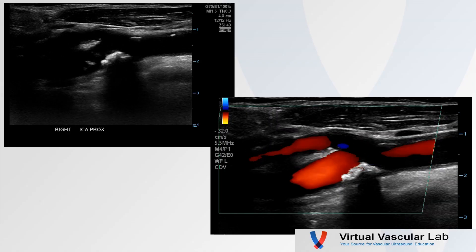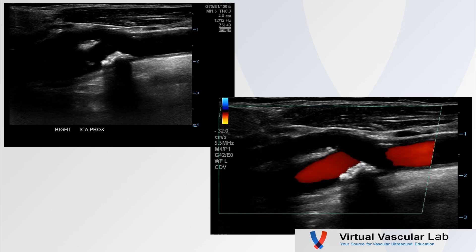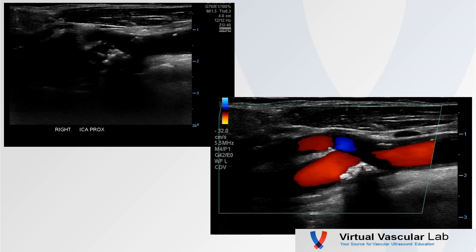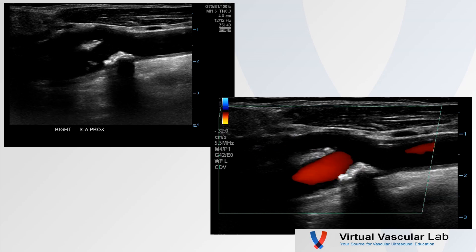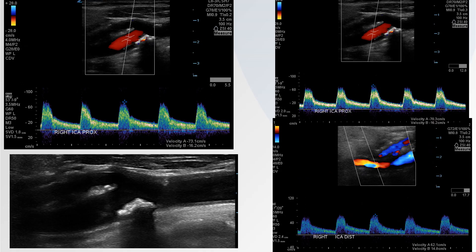Let's take a couple of video clips here. We can see a pretty nice view of the bifurcation — looks like we've got the external on top, internal on the bottom, and we can see some disease there. Here are a couple of spectrals: right at the stenosis in the proximal ICA upper left, just a little bit further distal at the exit of the stenosis upper right, and a spectrum from the far distal ICA in the lower right. Easy peasy — less than 50% stenosis. Our cutoff is 125 centimeters per second, validated to show greater than 50% stenosis. So this is certainly less than 50% — not hemodynamically significant.